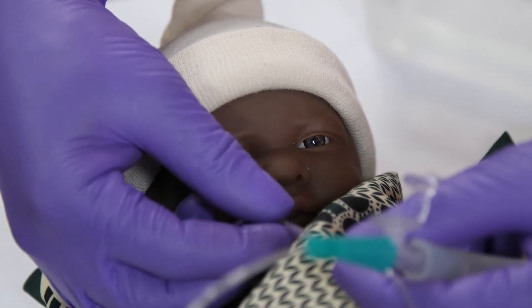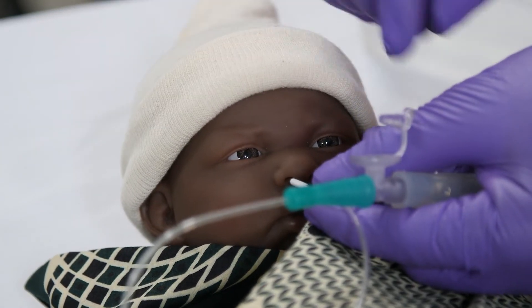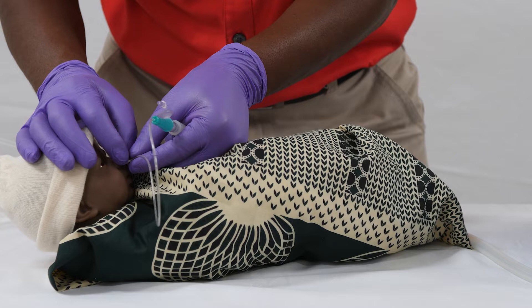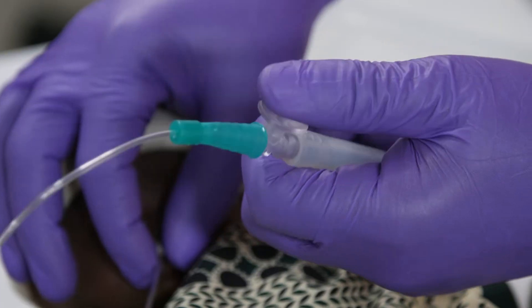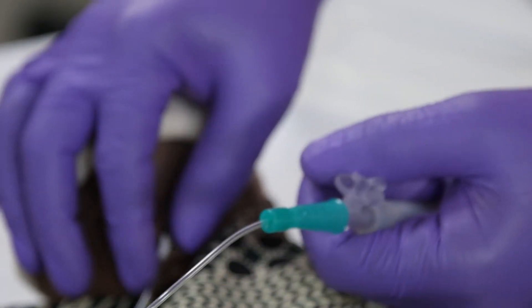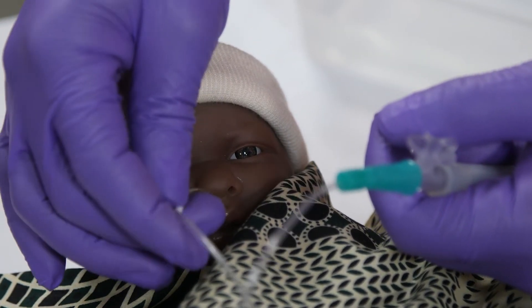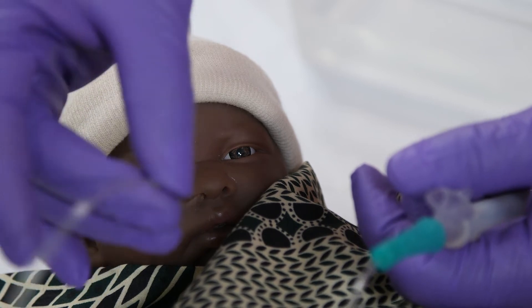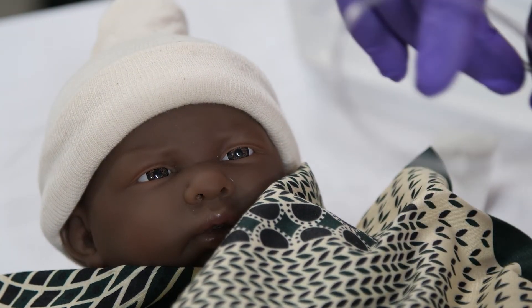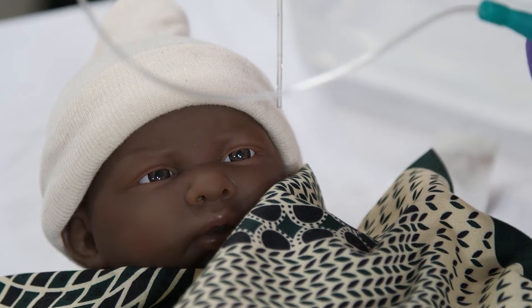Gently insert the catheter into the baby's nostril, all the way down to the tape marker. Limit the length of time that you suction to no longer than 10 seconds. Close the hole to create the vacuum in the catheter and immediately start to remove the tube from the baby's nostril, twisting it gently in a circular motion. Withdrawing the catheter must take no more than 10 seconds.